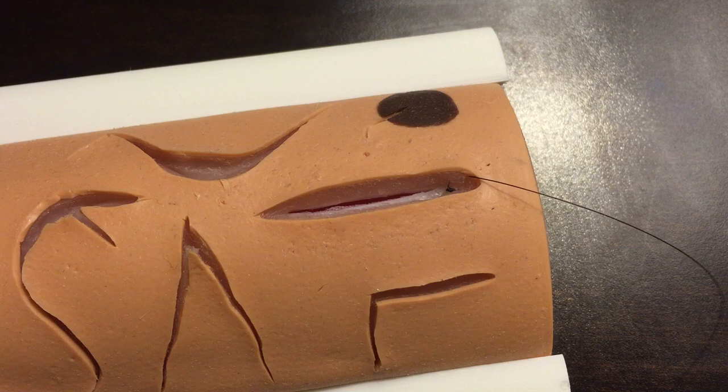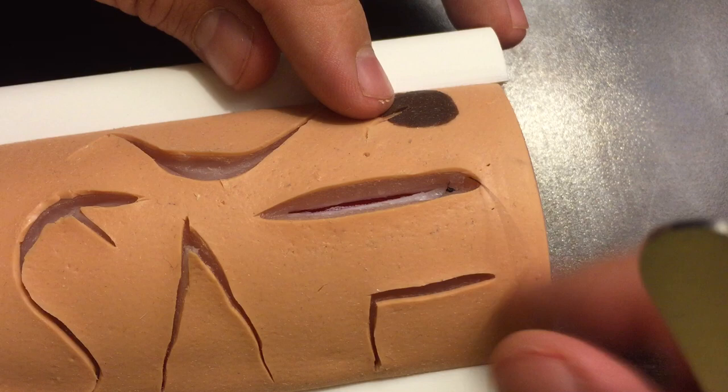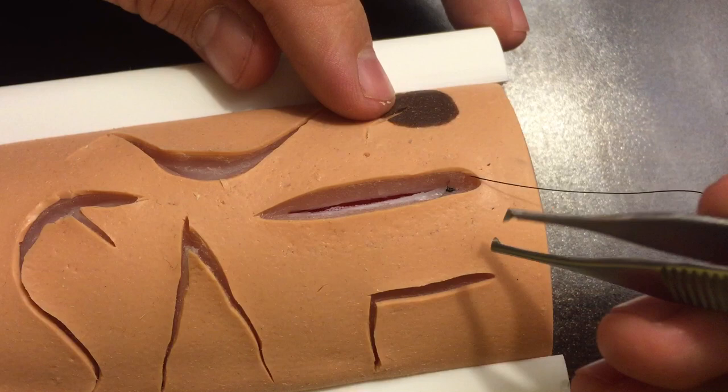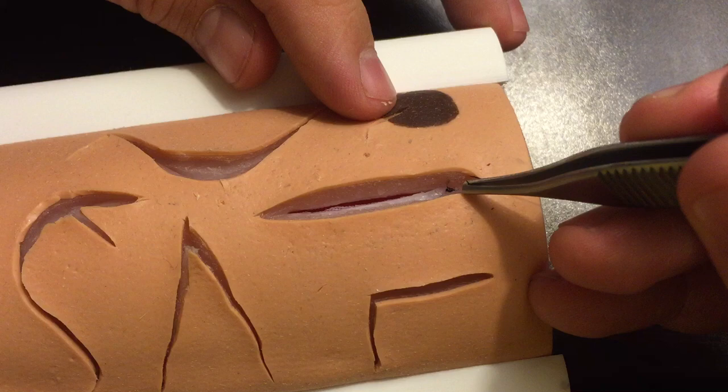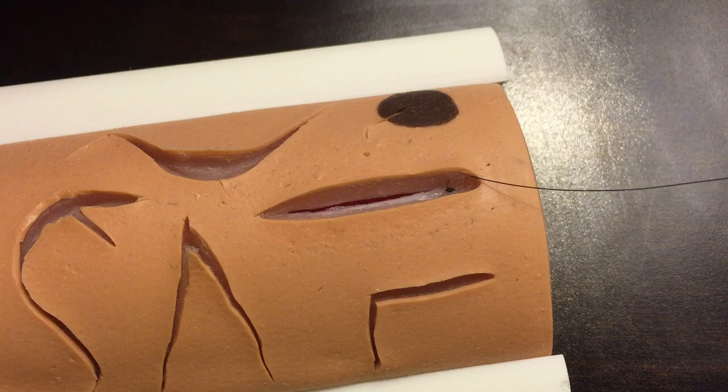Now I'm ready to jump across to the other side. The subcuticular suture is a continuous suture — basically what we're going to do is make a zigzag back and forth. Our suture continually goes back and forth in a curving S-shape all the way down. Rather than going from skin to skin, we go underneath the epidermis in a plane and pop out again underneath the epidermis, then cross into the same position on the other side and back.